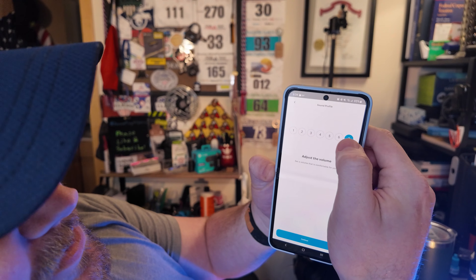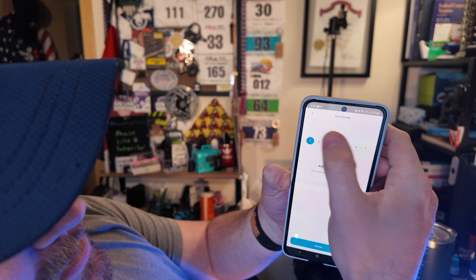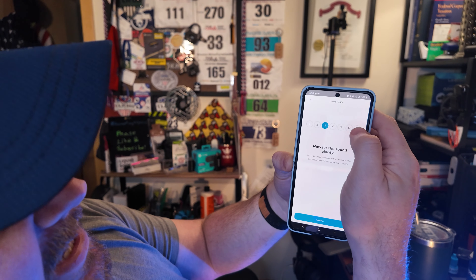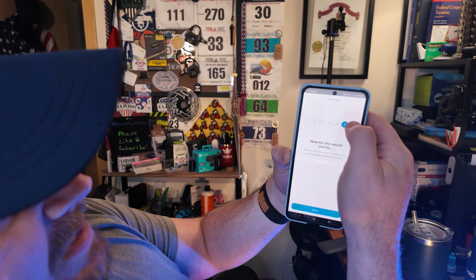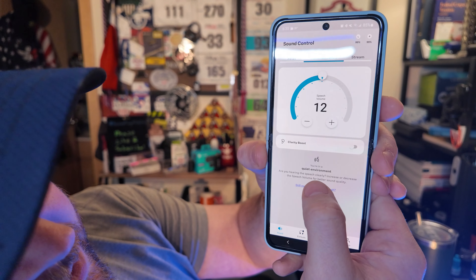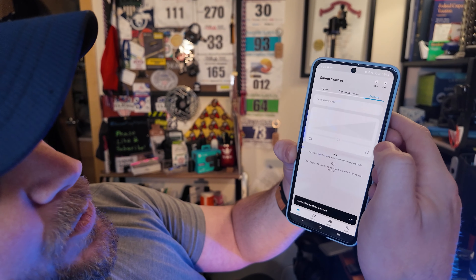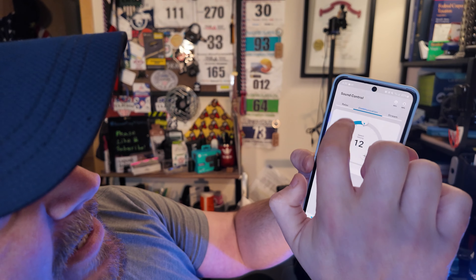Do you hear music? I do — excellent placement. So what it'll do next is go through more setup of tailoring the sound directly to me. It takes you through adjusting the volume to different levels — seven being the loudest, one being the quietest. Now they're applying my personal sound profile — pretty quick, easy setup right there. They feel comfortable in the ear, and isn't that really kind of what you're looking for if you're trying to find a hearing assistive device?